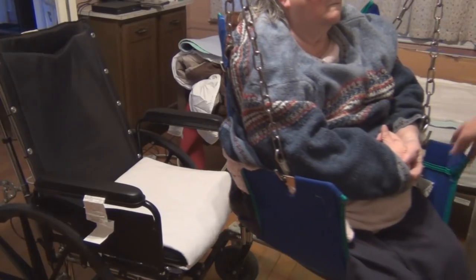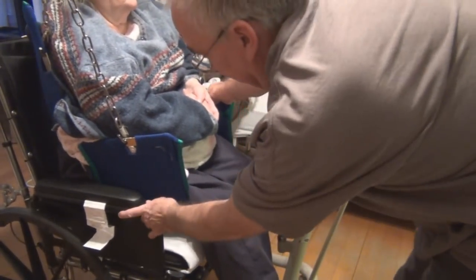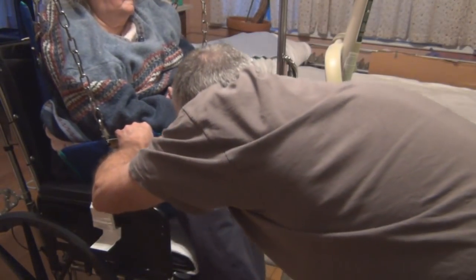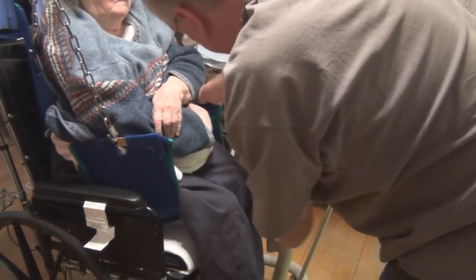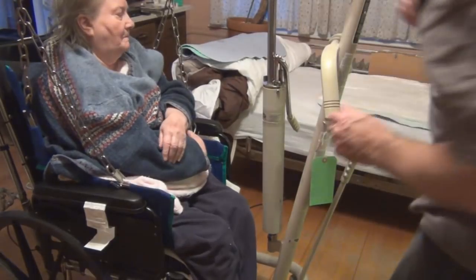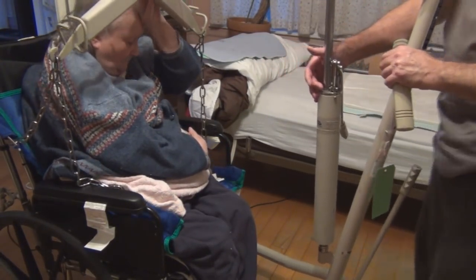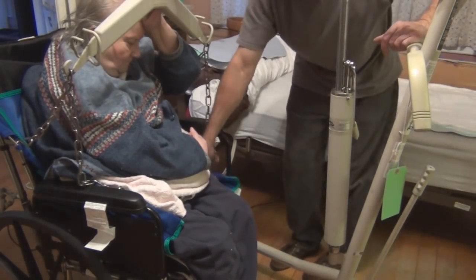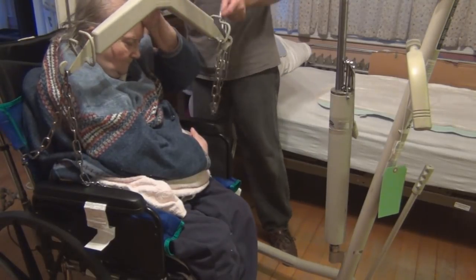Those brakes are really gripping into those new tires now. I've got the new wheels on the wheelchair.